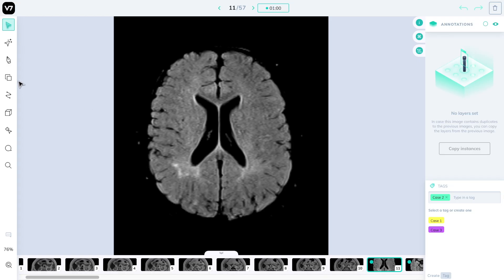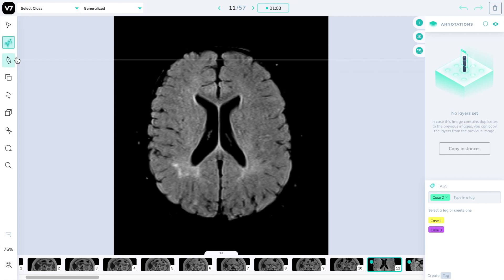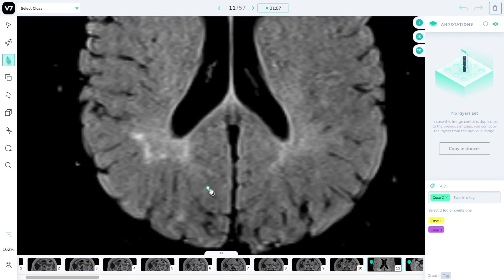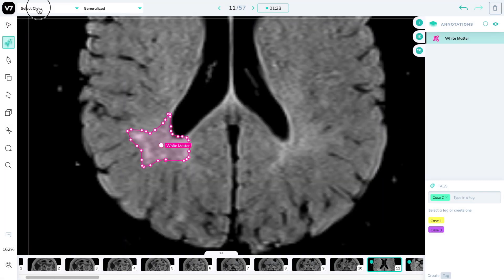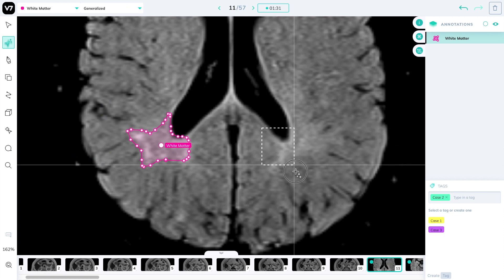Let's head back to the data and head over to our first case. Like most image annotation or DICOM viewers, Darwin allows you to manually label things within images by making, for example, a polygon mask. However, as an AI platform, it also allows you to leverage AI to make these annotations autonomously. We use auto-annotate — or N as a shortcut — to create segmentation masks automatically.